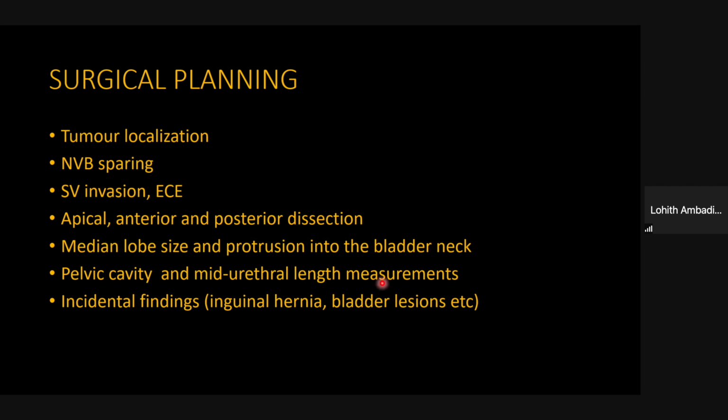And some studies have talked about evaluating pelvic size to look at how difficult the surgery could be for the robotic arms. The amount of space available in the pelvis for the robotic arms can be determined based on the pelvic size.